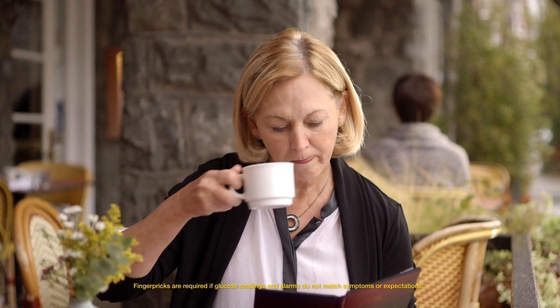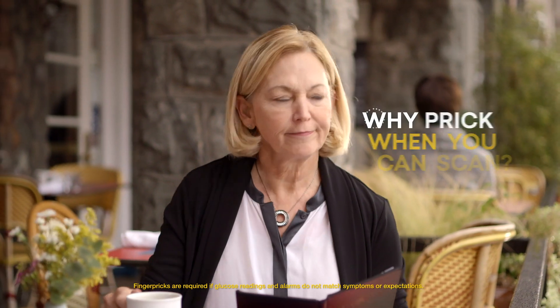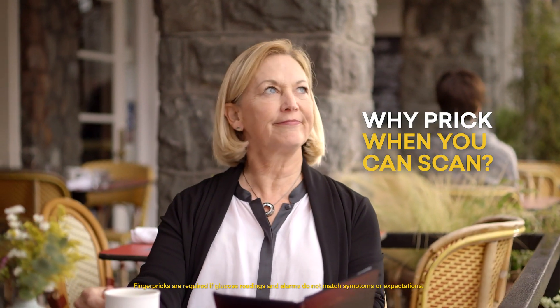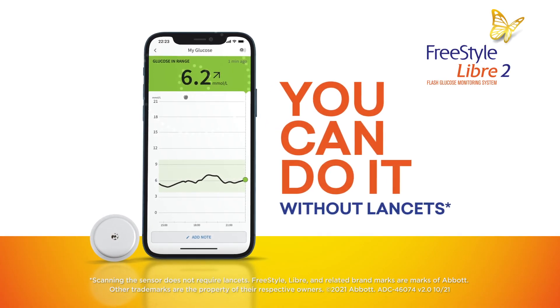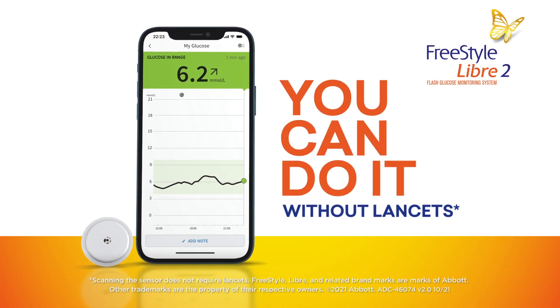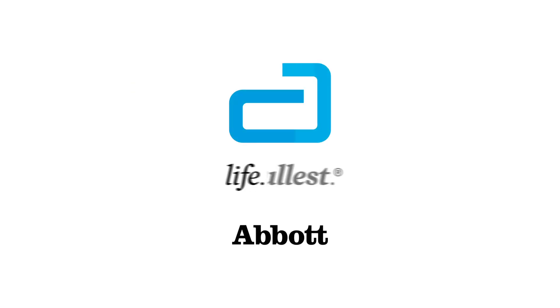The FreeStyle Libre 2 system liberates you from the hassles of routine finger pricks. Why prick when you can scan?